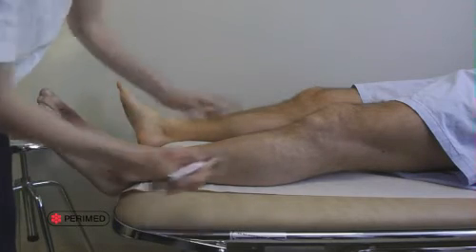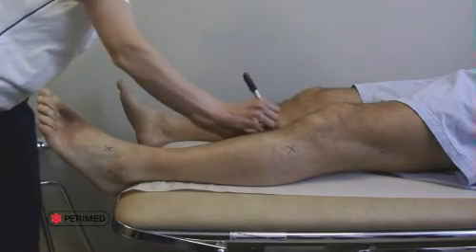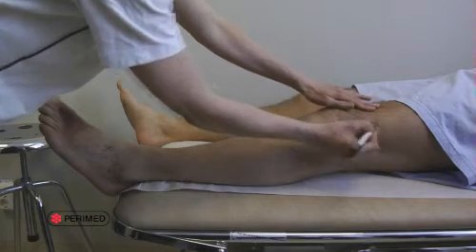The next topic is predicting amputation healing. Unfortunately, many patients with leg ulcers require amputation. The goal is for the amputation to be performed at the most distal level possible in order to maintain the best possible function. However, the more distal the amputation, the more likely the surgery is to fail. So TCPO2 can be used to find the optimal level of amputation, hopefully preventing failed surgeries.